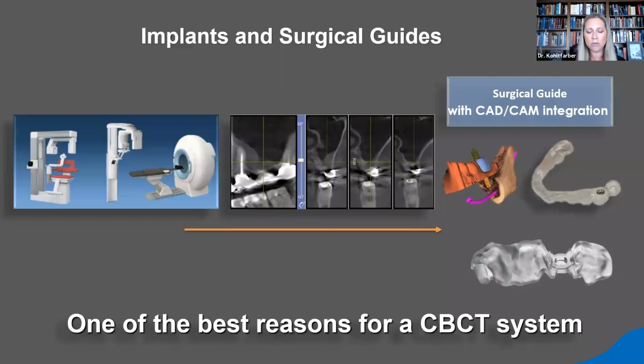We actually tested this out with some of our students. We did a couple of different kind of pilot studies with various imaging companies. And we found that even with, say, our third year dental students that are just starting to place, our class 2 and 3 restorations, they're just getting up on clinic, they were able to place implants appropriately and repeatedly in the correct position. And the variation in their repeatability, I think, was like 0.4 for one of the pilot studies and 0.3 for the other. That's pretty nice accuracy and repeatability there.